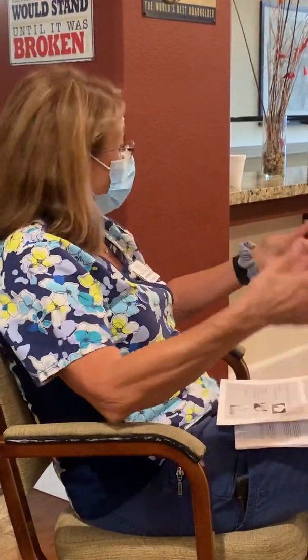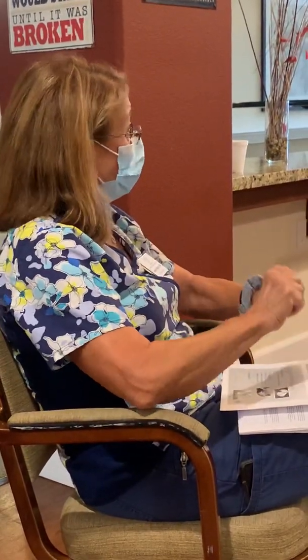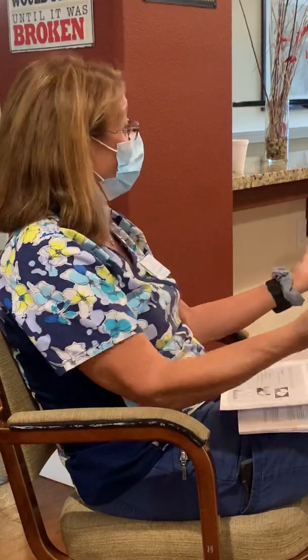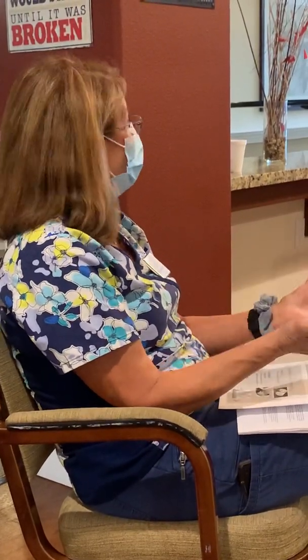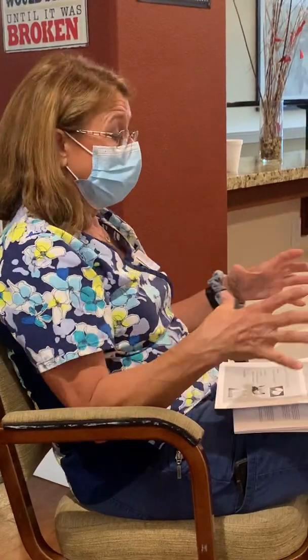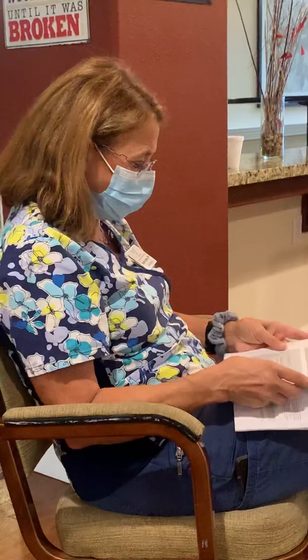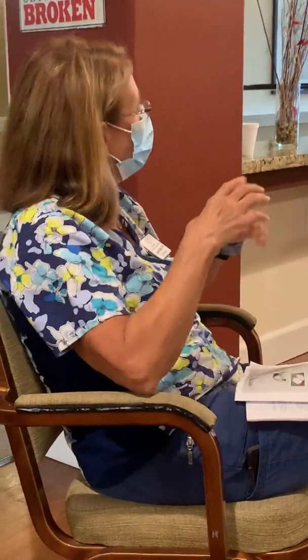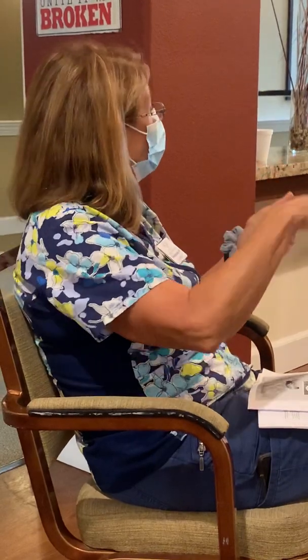Also, if you have patients that are in bed, get one of those bath buckets and put the Foley bag in the bath bucket. That way it's not riding on the floor. That's also a vector for infection. So make sure that it's in a protected little container like those bath things. And then also make sure that none of the tubing is kinked or looped.